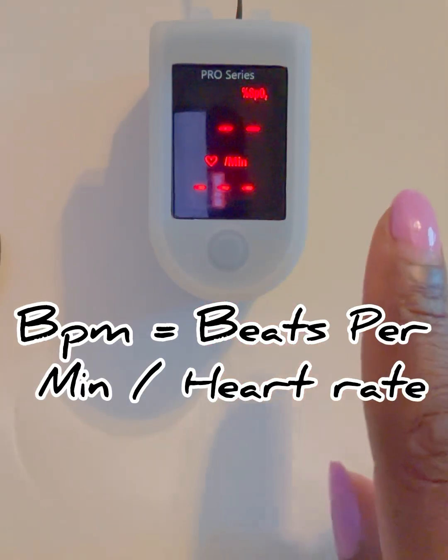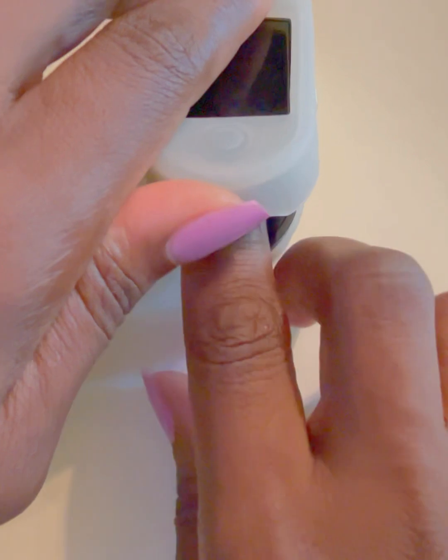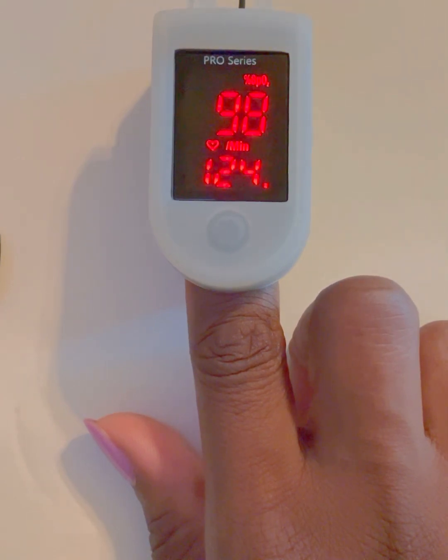Place your fingertip — usually the index finger or middle finger — into the device and wait for a reading. The reading typically takes between five to ten seconds, after which your oxygen saturation and pulse rate will appear.